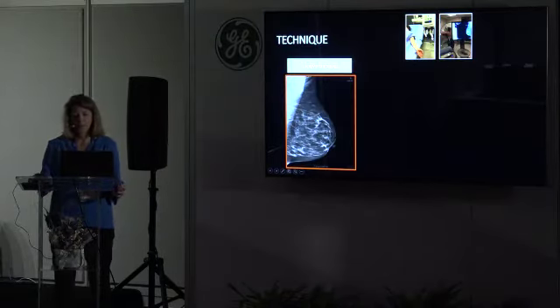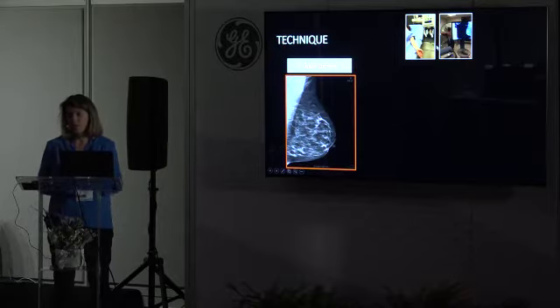So here is an example. We have the ultrasound bed inside the mammography room, and we have plenty of time to position and install the patient in the mammography unit. Usually, we start the examination 2 minutes after injection. So we have 2 minutes from the beginning of the injection to the start of the images, so we don't have to rush. It's really, really easy.